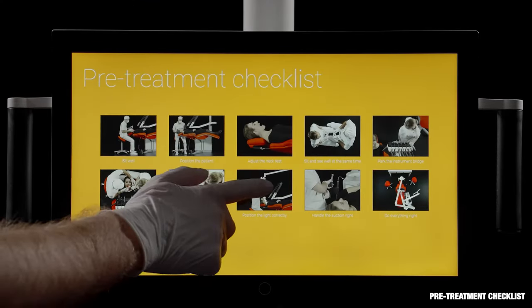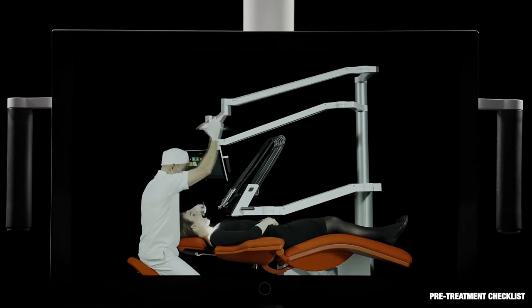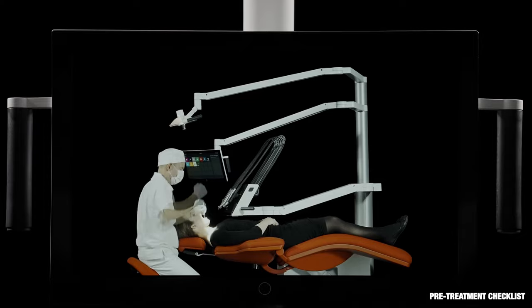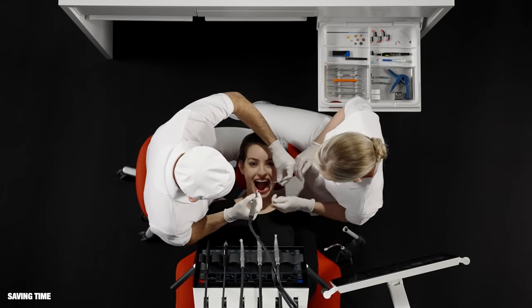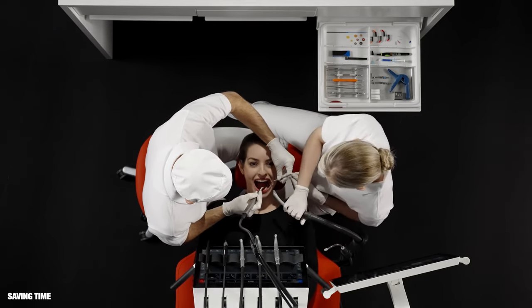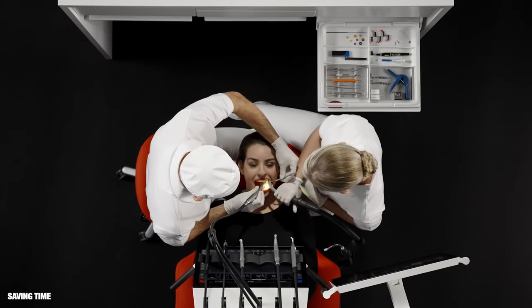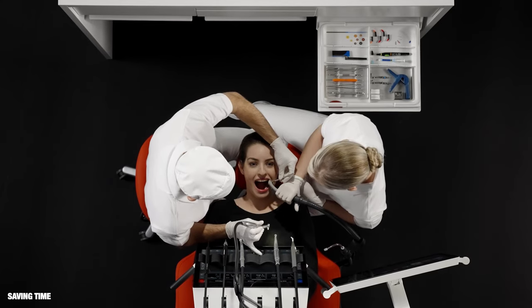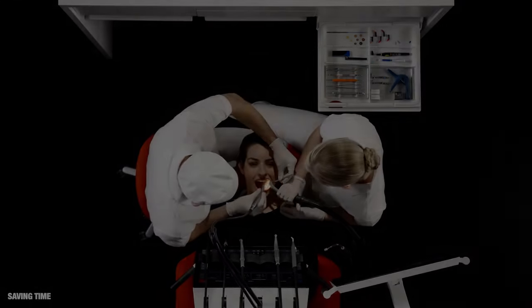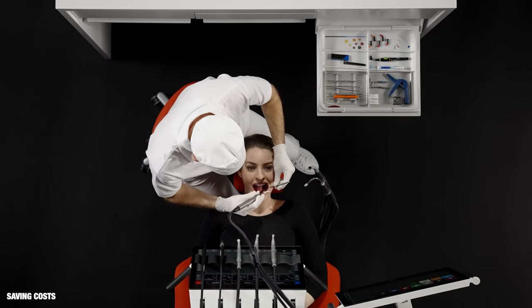A pre-treatment checklist app enables the user to get familiar with the unit. The chair-side assistant hands the instruments to the dentist while using the suction. Both the dentist and the assistant can adjust instrument settings using the dashboard. The dentist may also be his or her own assistant.